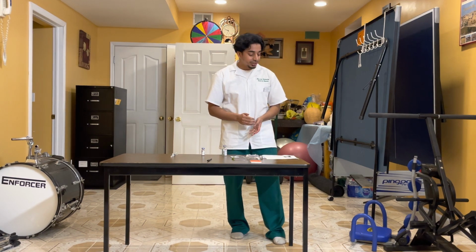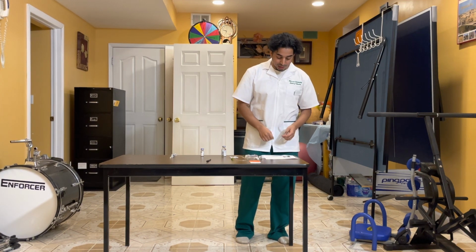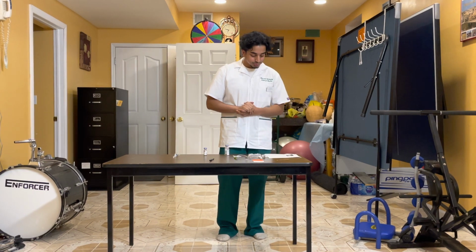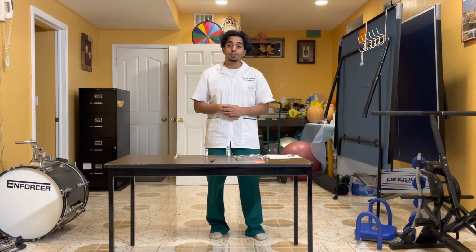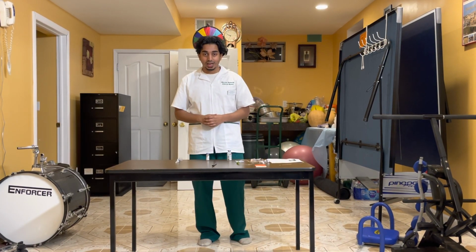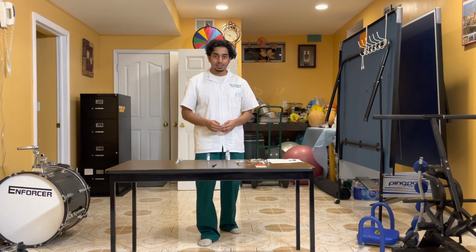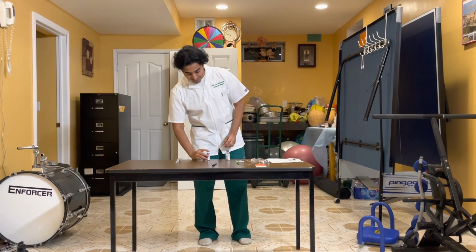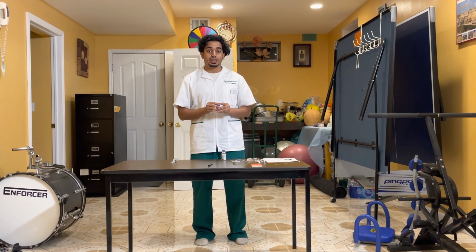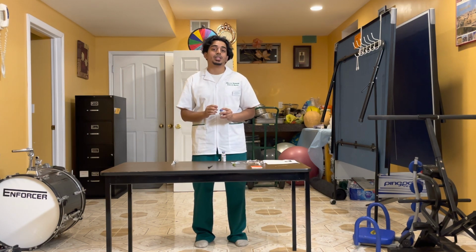When I see the order, I notice that it's the right patient, the right medication, the right dose, the right route, as well as the right time. So the order is perfectly fine. Now that I have that done, I will be taking out the medications. I pull out my vancomycin, as well as my normal saline. The first thing I do is assess the medications and make sure that it is the right medication. I make sure I assess the medication with the MAR 3 times. Scanning the barcode does not count as one of the 3.